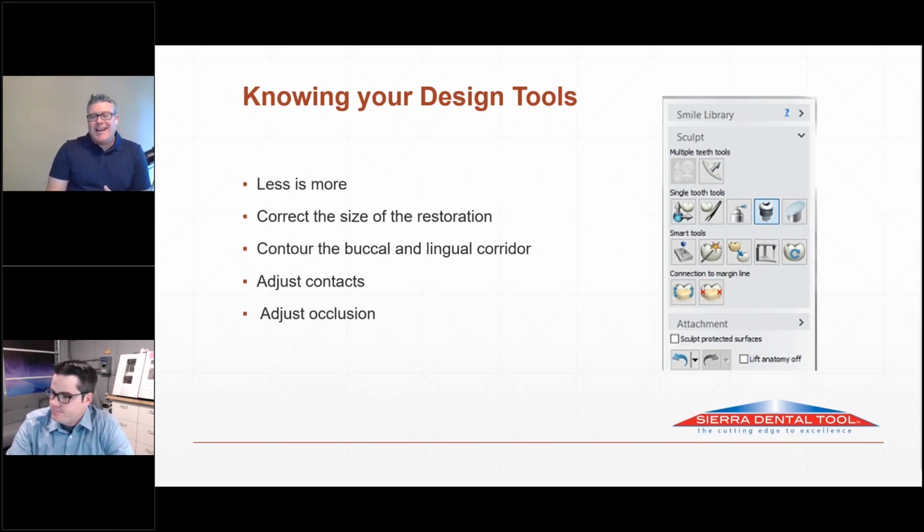A lot of people don't utilize the auto features of the software. Yeah, some of them are kind of glitchy, and they all have their own little, as we call them, nuances. Character. But that's adaptable. So, like some people want it out of occlusion 3/10 because when it goes to the mill, it actually is only 1/10 out, or 2 pieces of credit card material. I mean, there's different things that the more that you design and the more that you're talking to the finisher, the better those crowns are going to come out. But most people don't spend the time touching every button in the software.